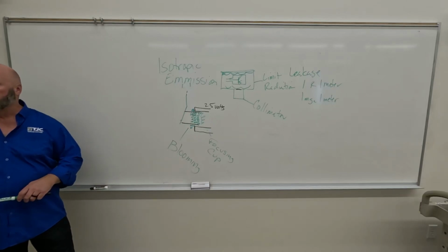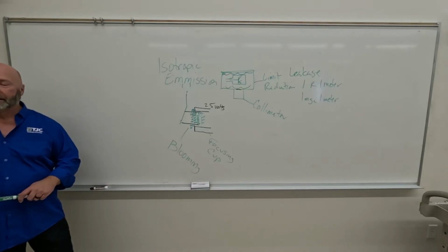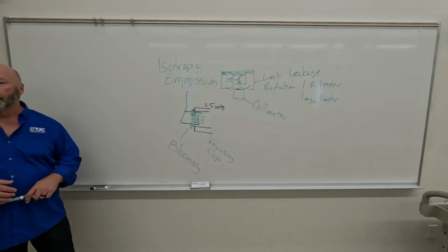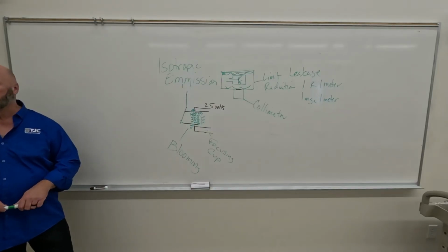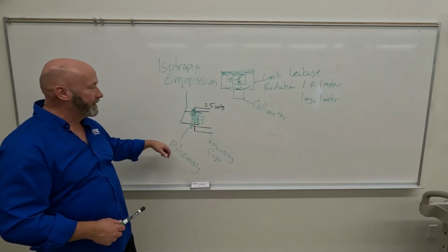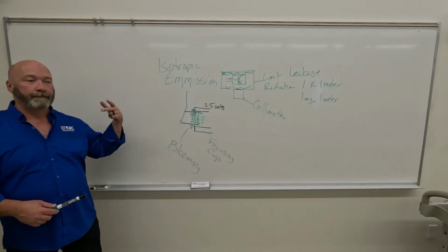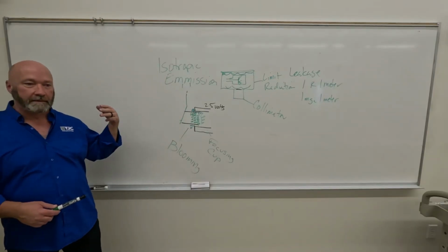If you're in surgery and you're waiting for the doc to inject contrast into the patient, you've got to be on that rotor button. So there are times that you need a longer prep time, but most of the time you do not, right? So blooming of the space charge, high mA, long prep times, lose sharpness of recorded detail, shortens tube life.